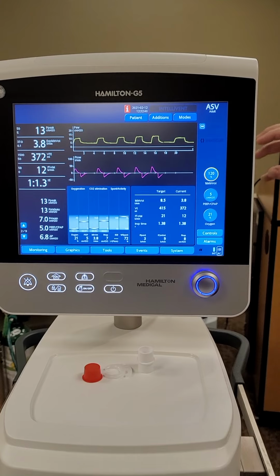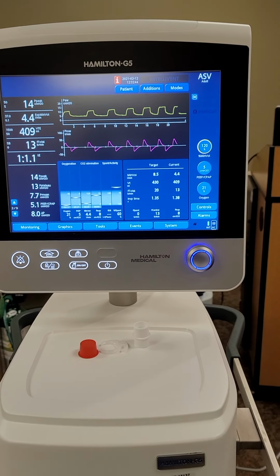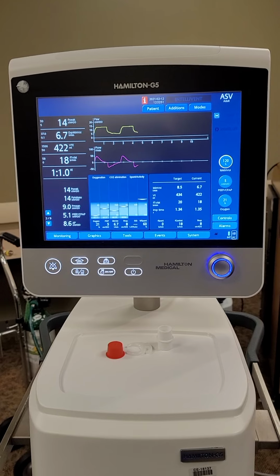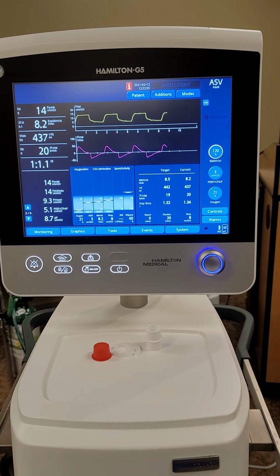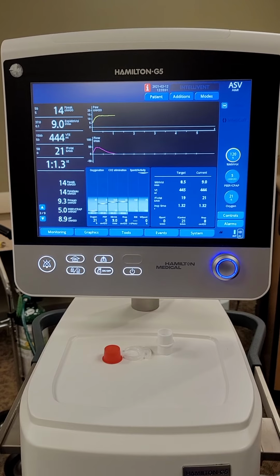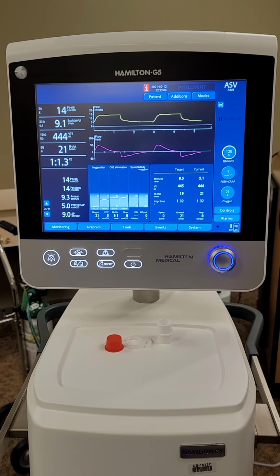This kind of takes some of that out. I mean, it's still not a silver bullet, but it will help with your patient synchrony, for sure. We tried that in Villarica, and on a couple we were successful, but a couple it was just too late in their COVID ARDS. But say you had somebody that was not in synchrony with the vent, and their minute ventilation was, I don't know, pick a number, and their blood gas didn't look great.